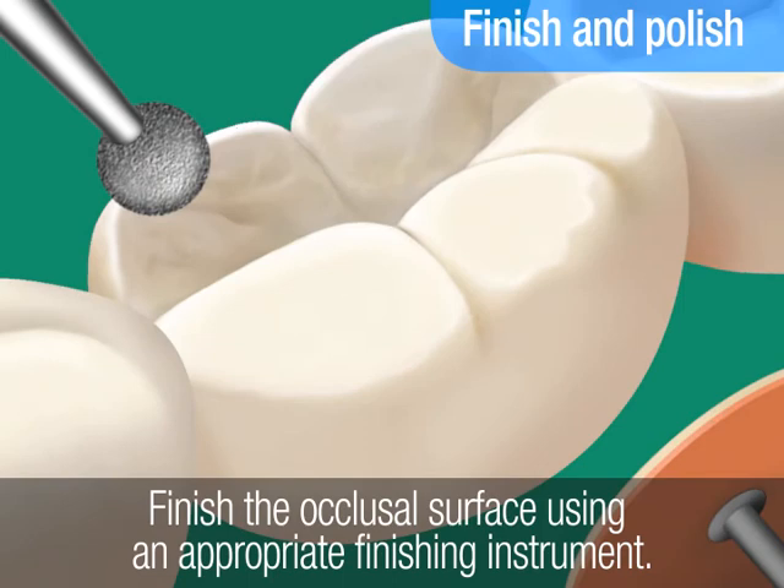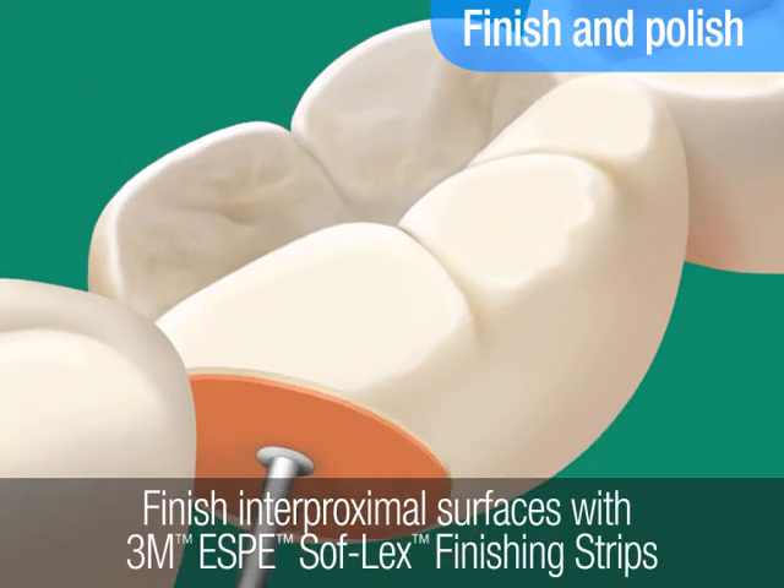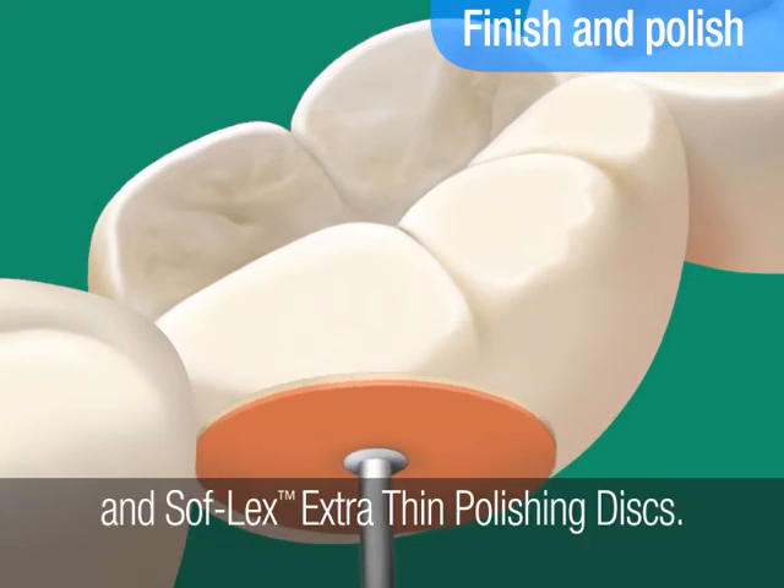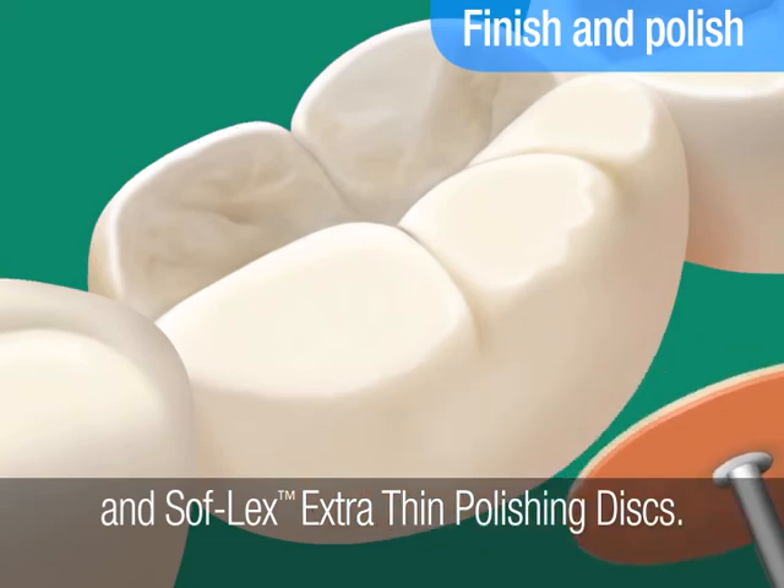Finish and polish the occlusal surface using an appropriate finishing instrument. Finish the interproximal surfaces with 3M ESPE Soflex Finishing Strips and Soflex Extra Thin Polishing Discs.